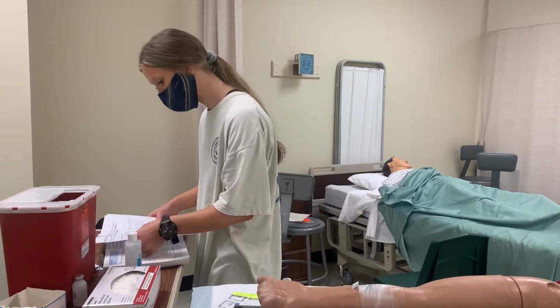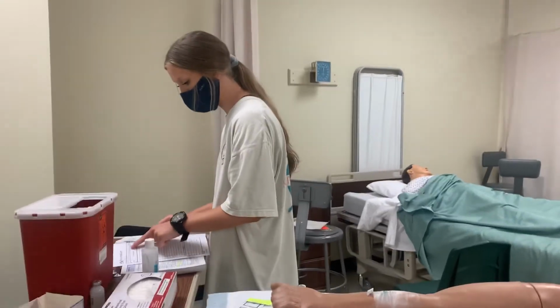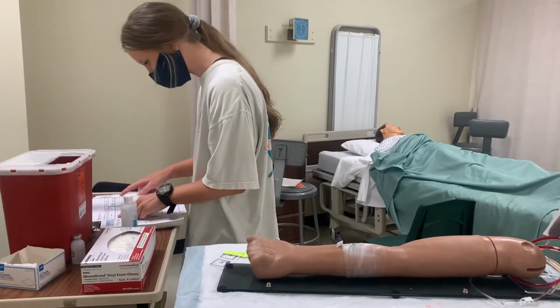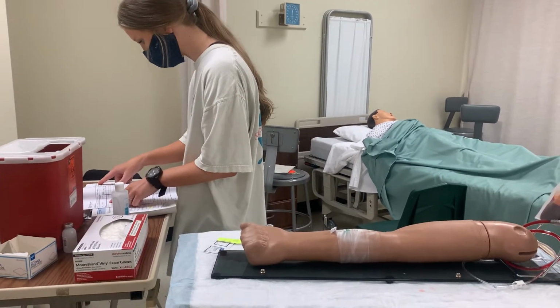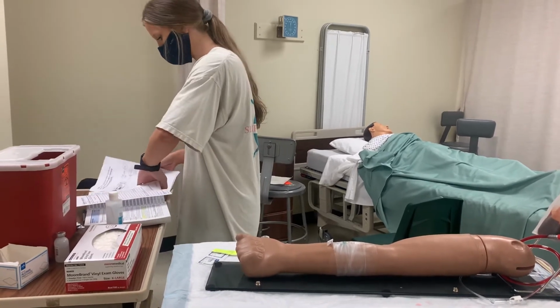Alright, so I'm going to check it against my MAR. I have the patient John Smith, whose birthday is 3/23/91. That's the same, and he has no known allergies, and 20 milligrams of furosemide IV push. So everything matches my MAR compared to my order.